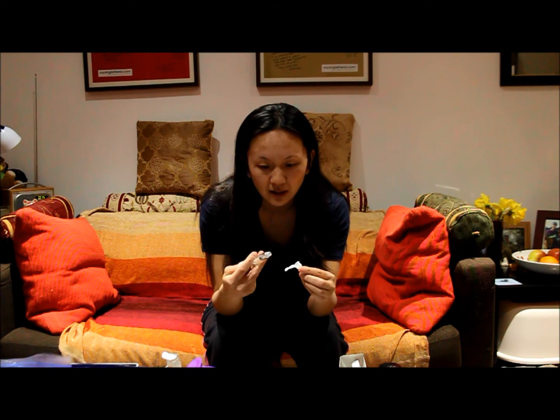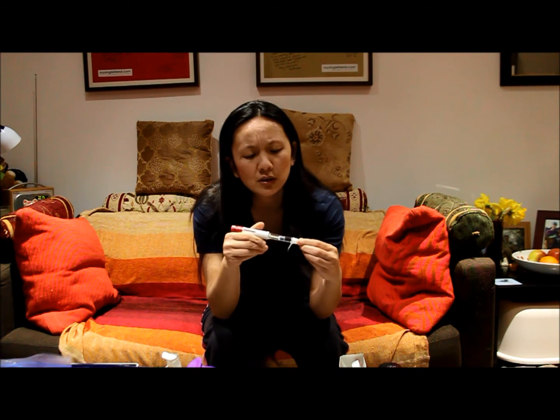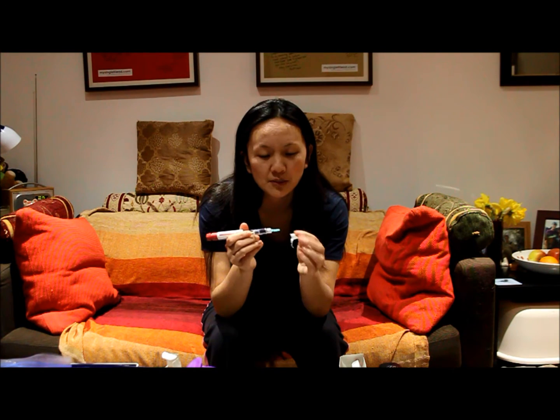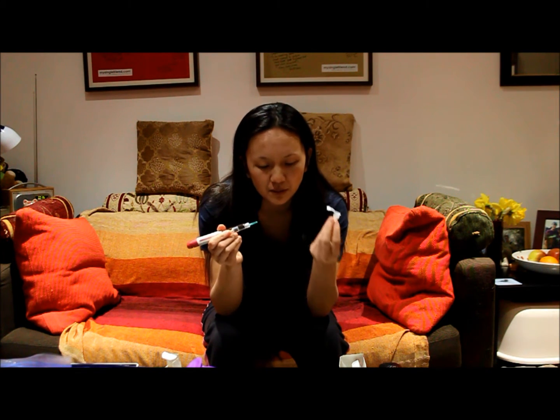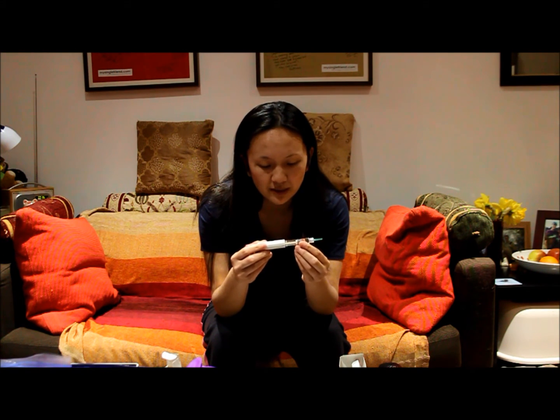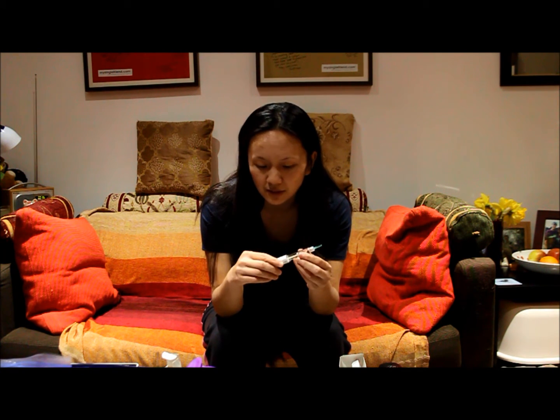Next, get your pen needle. A lot of people just yank the whole seal off — I don't like to do that. I just put it just onto the edge so it still sticks, then with your pen and the rubber end, you put it in and turn clockwise until it stops and won't turn anymore. You can then pull off the outer cover — you don't have to worry about jabbing yourself because there's an inner needle cap. Put that down, don't throw it away — and there you are, your needle is all ready to go.